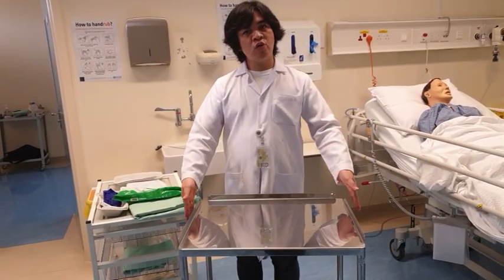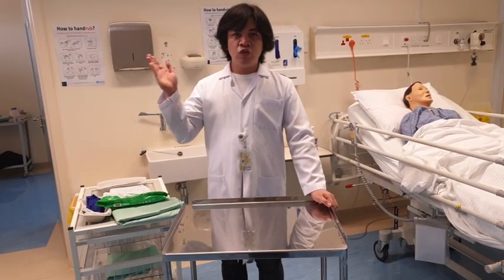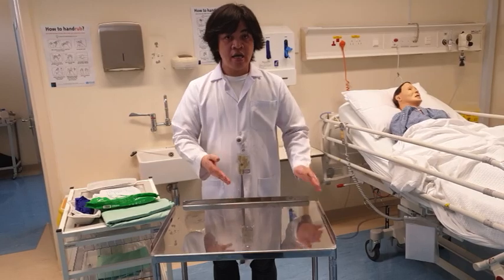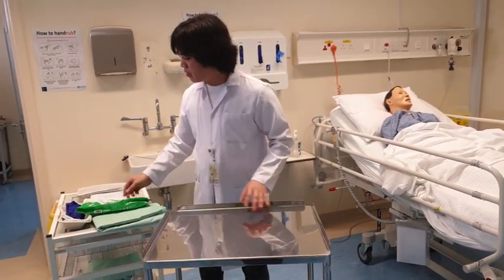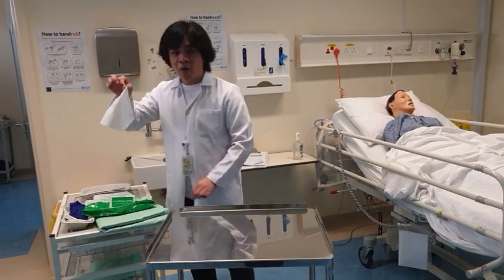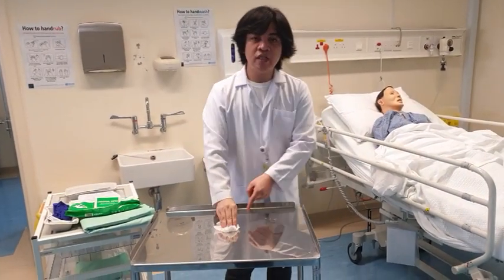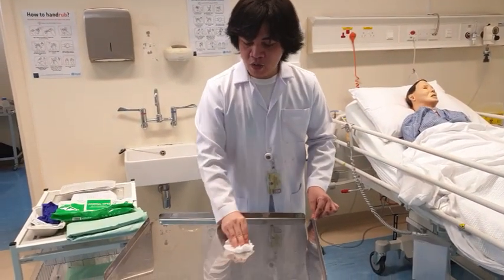Why do we need to clean this trolley? Because this trolley might have been used for other patients. It might have some microorganisms there, and before we bring it to the patient, we need to disinfect this first. So you get some wipes and start cleaning the trolley starting from the top, starting from the center in circular motion like this.